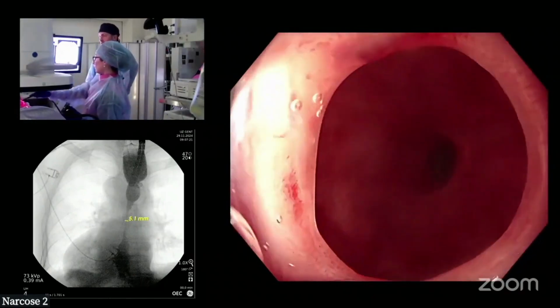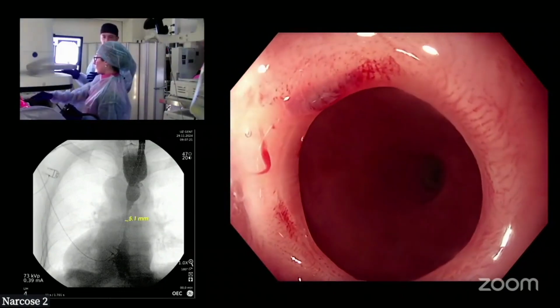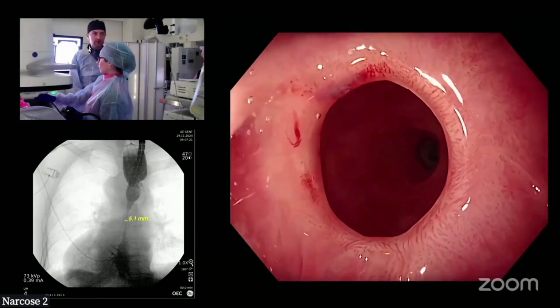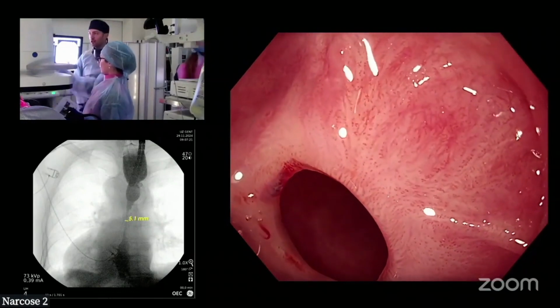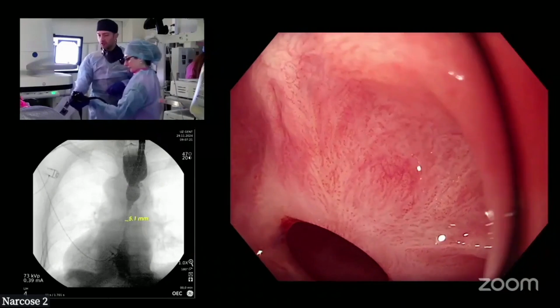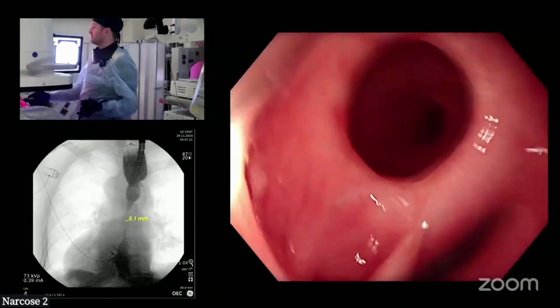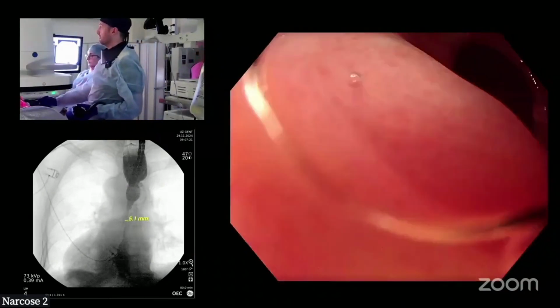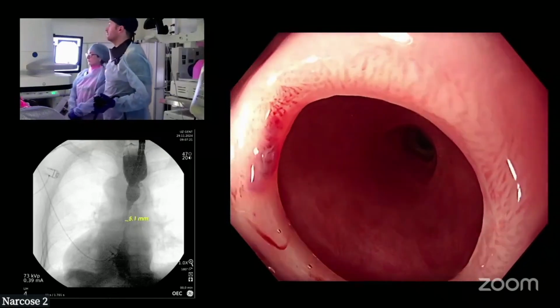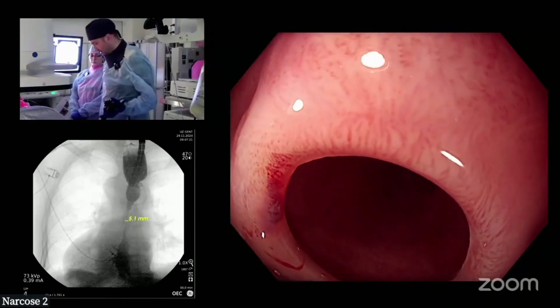And I think incisional therapy, what is the benefit of incisional therapy? For the top, let's first needle knife. The benefit of incisional therapy for the top is to get it to open in a systematic way. Okay, so let me do the incisional thing and then you do the other thing. A cap is actually quite useful for incisional therapy. We'll try without it, but if we need it, we will. Other people got comments on this while we're just preparing the needle knife?